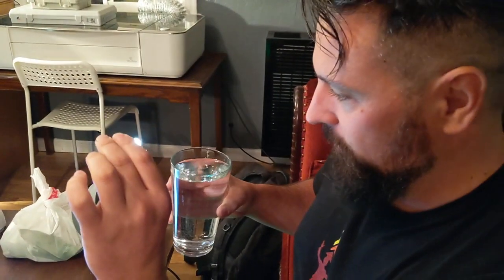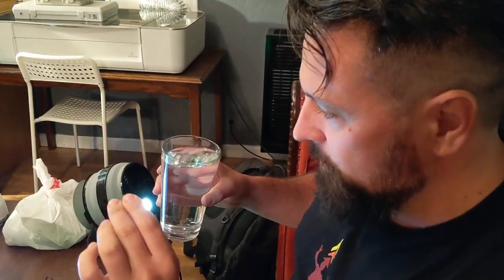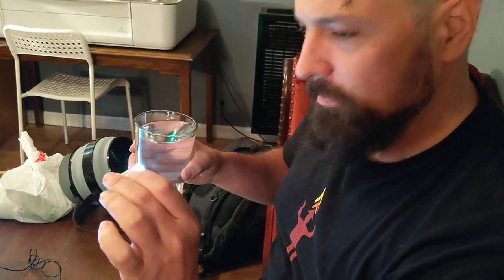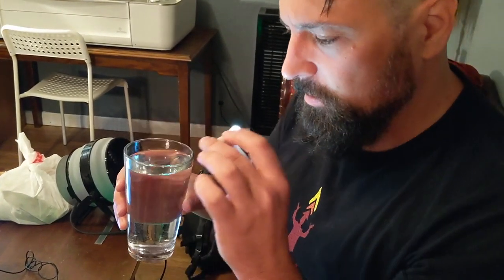First in human. Let's see what happens. Do you want me to do a little power check? We're a little hazy, but we've got motors. All right, guys — down the hatch. Drink, drink, drink, drink, drink.